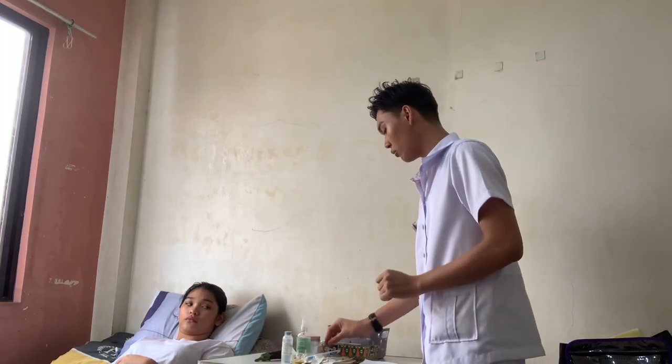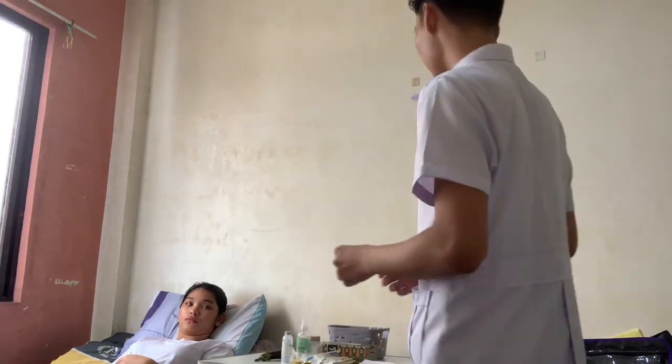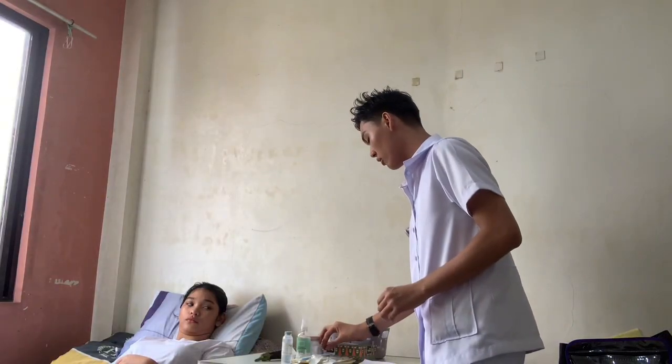For an ampule, what we would want to do is to flick the stem of the ampule. But before doing that, I will wear gloves for safety purposes.